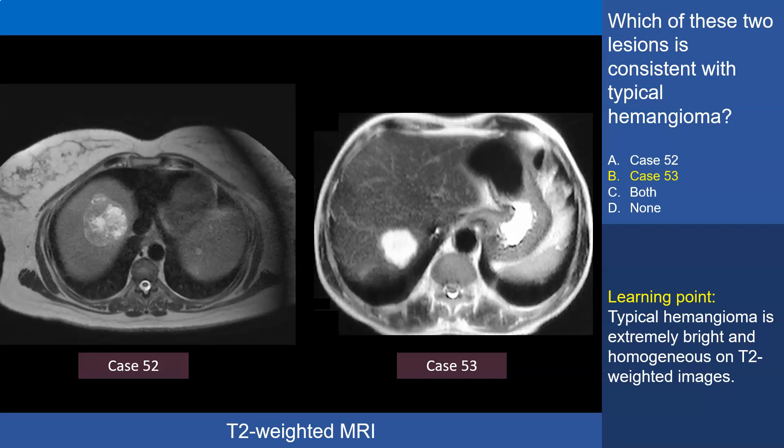The correct answer is case 53, which is a hemangioma. In case 53, you see the extreme hyperintensity and the extremely homogeneous nature of the lesion, in contradistinction to case 52, which shows heterogeneous signal intensity. Case 52 is a metastasis. The learning point is that typical hemangioma is extremely bright and extremely homogeneous on T2-weighted images.